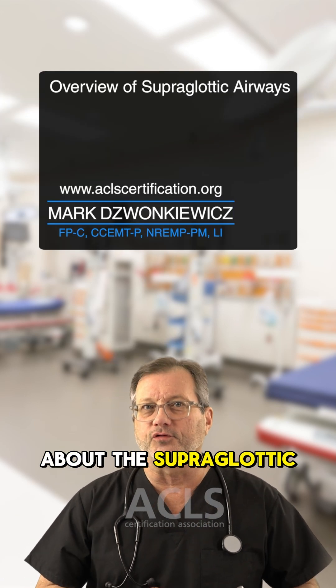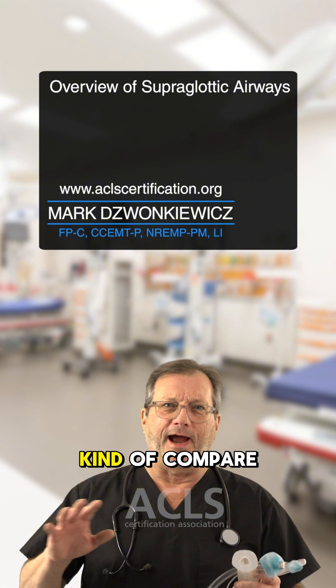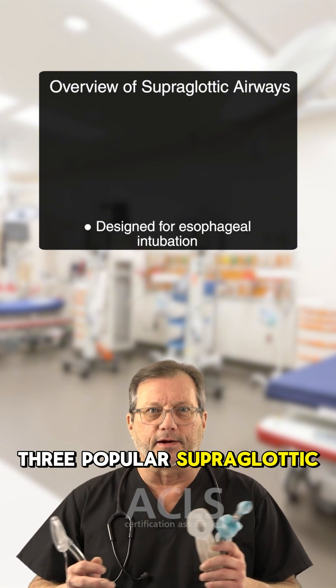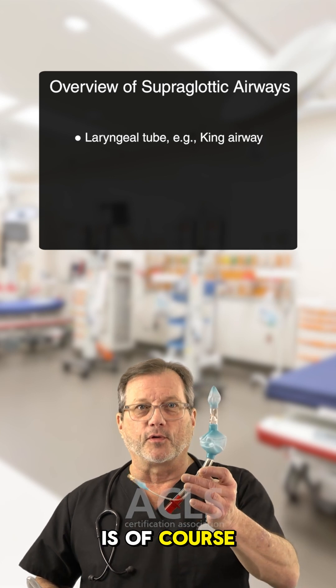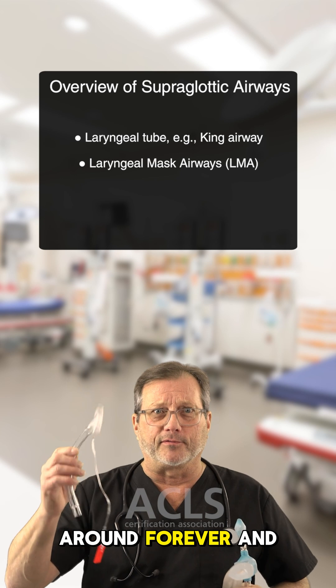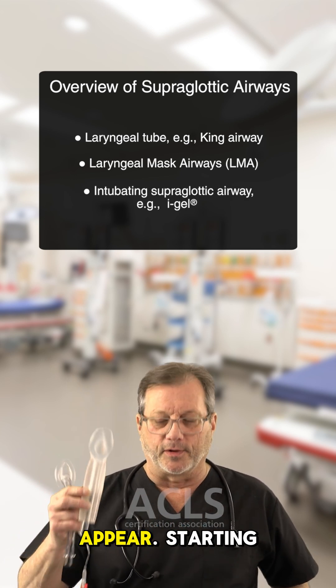Today we're talking about the supraglottic airway and we're going to compare and contrast three popular supraglottic airways. The first is of course the King Airway. Then we have the LMA, which has been around forever, and then we have the iGEL, the latest to appear.